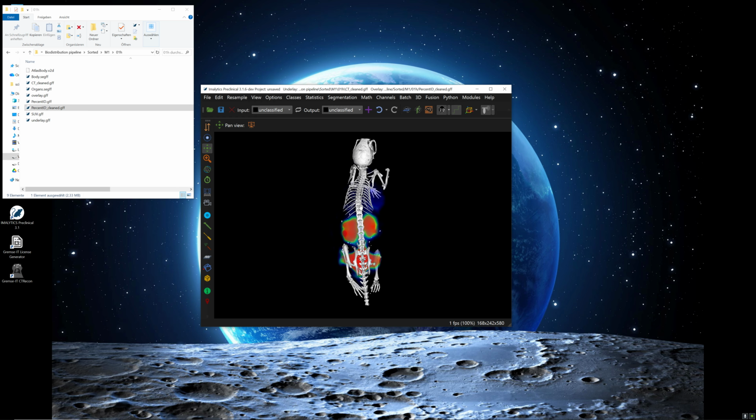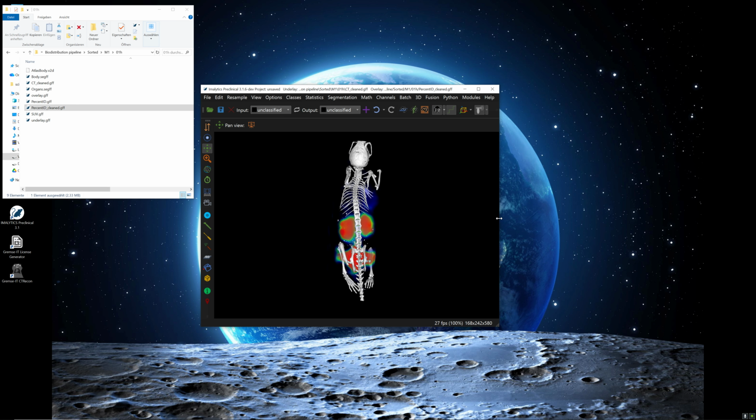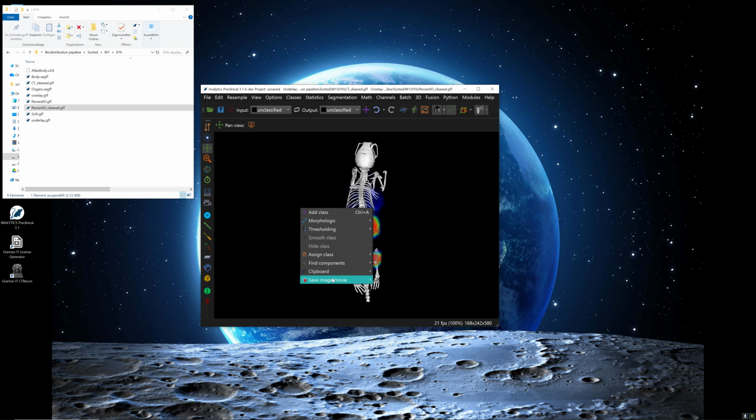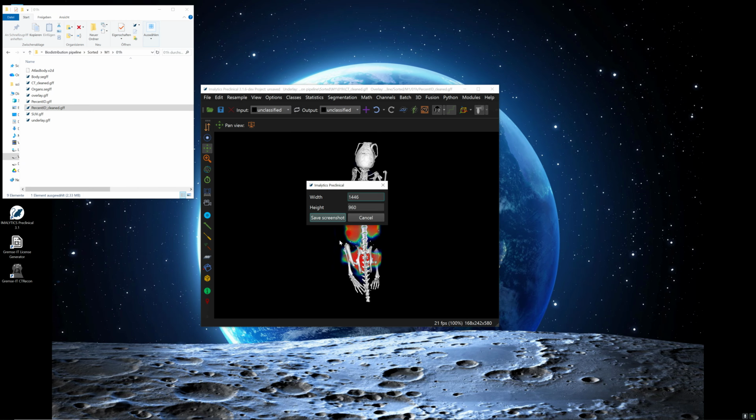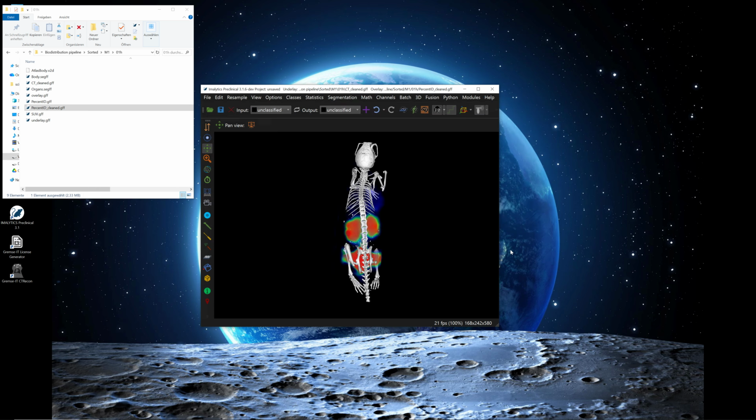Mouse a little bit bigger. Use the plus sign here, for example, as a middle. So the smaller you make the window, you can also make it small like that as you wish. Then everything else around is also cropped and you don't have so much area around. Then I will go to save image, save screenshot, and save it, for example, as 3D rendering. And this I will do quickly for every mouse.